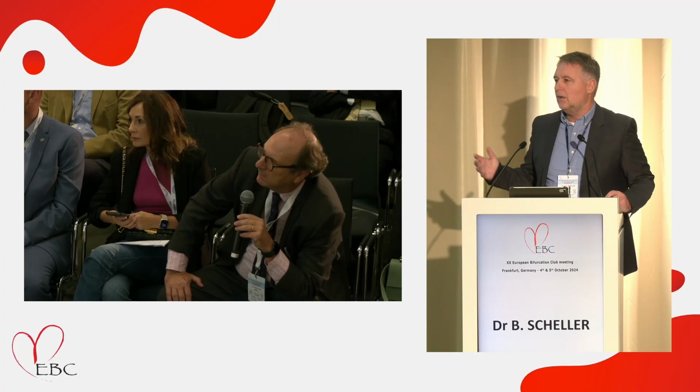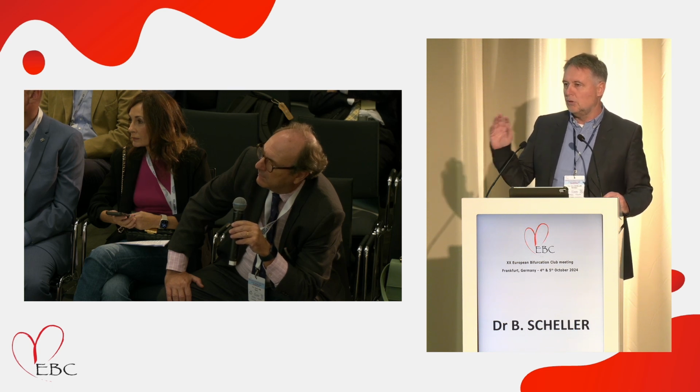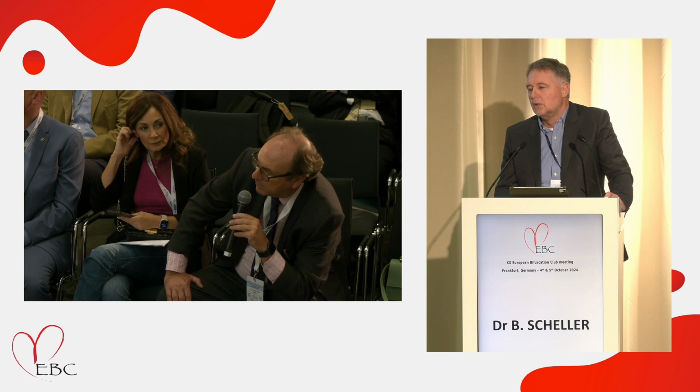Congratulations for your presentation. Do you think that the drug-eluting balloon is the choice treatment for 001 lesion? Do you think it's better than inverted provisional with the stent? I mean, if I have only this problem with the proximal or the ostium of the side branch, I think it makes sense not to implant a stent to avoid the carina shift and go with the balloon after lesion preparation.